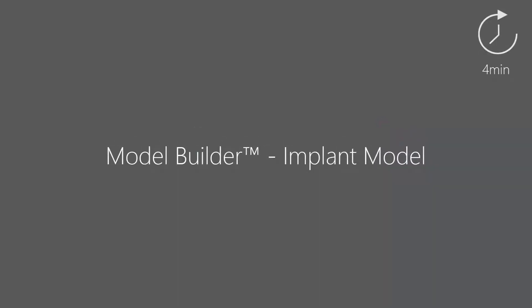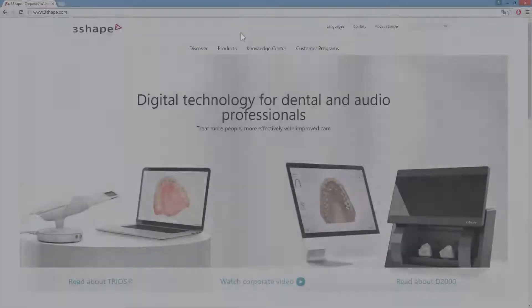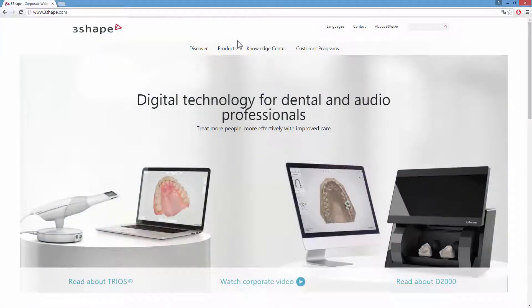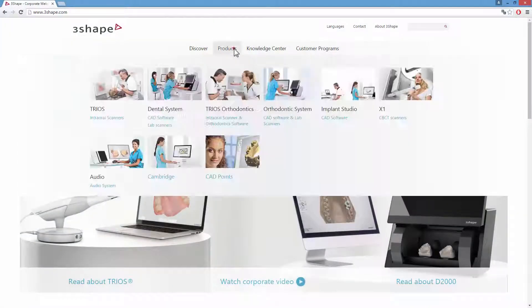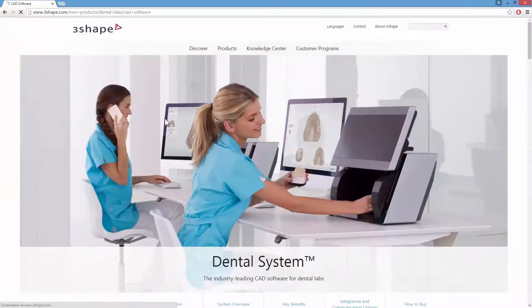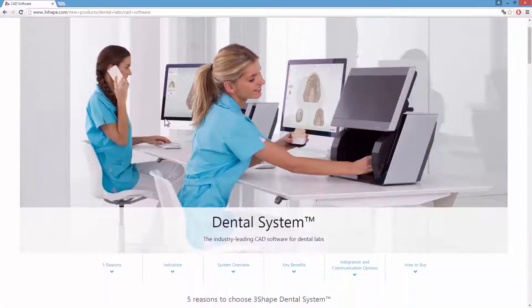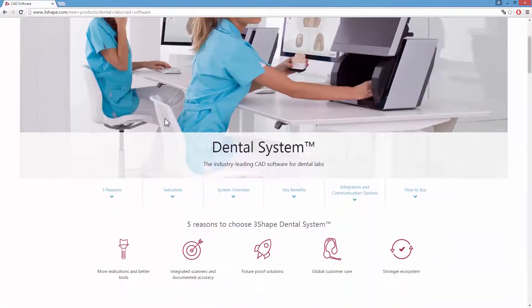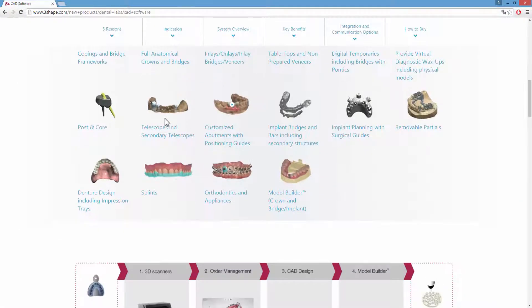In this video, we will show you how to create a digital model for implant cases. 3Shape's Model Builder enables model design for implant cases. Choosing a specific implant library shouldn't be a problem, since Dental Systems supports a wide variety of implant systems.